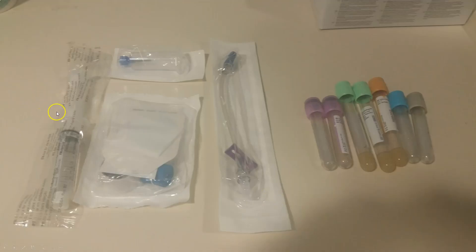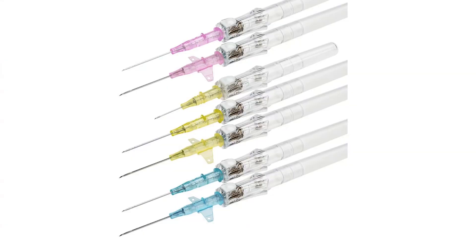The second thing you need is equipment — all the blood tubing you might need, a connector, a vacutainer, start kit, and a flush, which you should all be familiar with from the regular IV access approach. But most importantly, you need a long IV catheter. There are multiple different sizes, and typically the teaching is that you want the longest catheter you can get — usually ones that are just about two inches long. You don't want to use a short or regular catheter because when placing an ultrasound guided IV, the vein is typically significantly deeper. If you use a regular catheter, there would be a very small amount of catheter left in the vessel, likely leading to higher rates of failure.